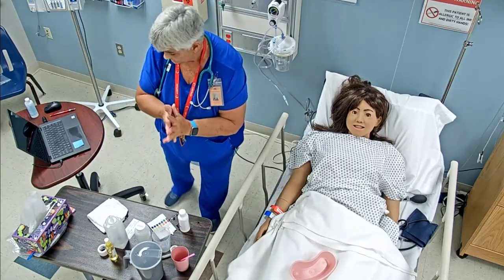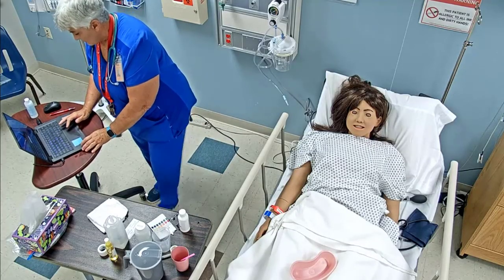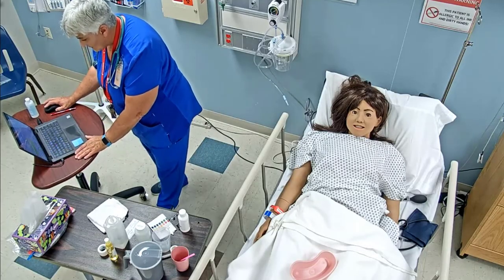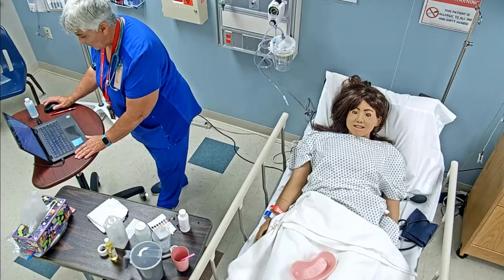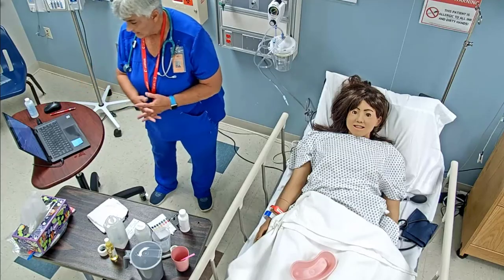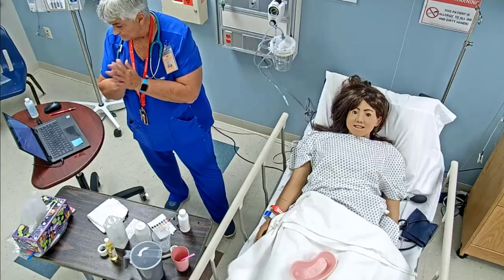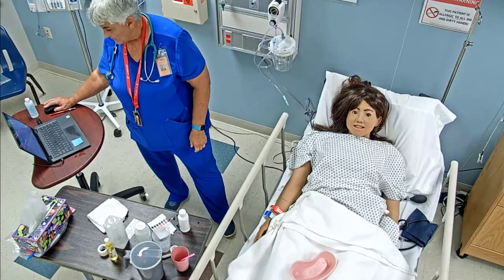And then I'm going to step over here, and again, I need to document. Okay, so in my documentation here, just as we did before, we're always going to be making sure that we notify the healthcare team if there were any unusual or abnormal findings.